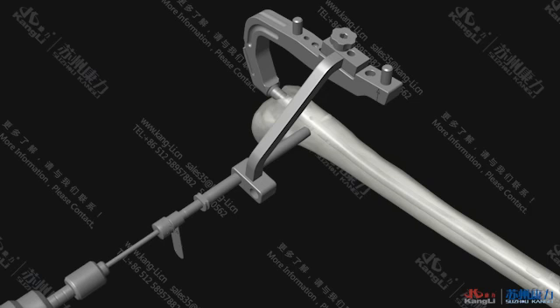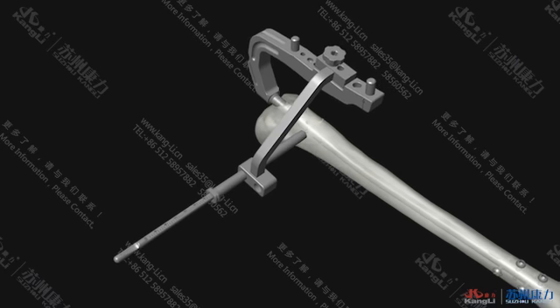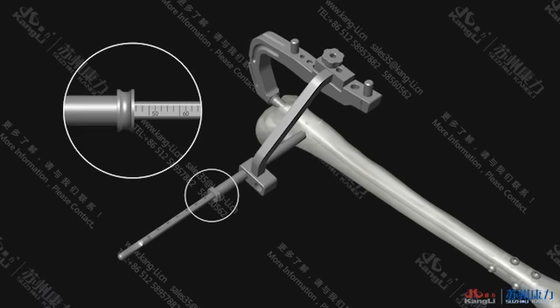Then continue drilling until the contralateral bone cortex is drilled through. Remove the phi 4.0 drill bit and phi 4.0 inner sleeve. Keep the outer sleeve closely contacted with the bone cortex and insert the guide depth gauge to measure the diameter of the bone.